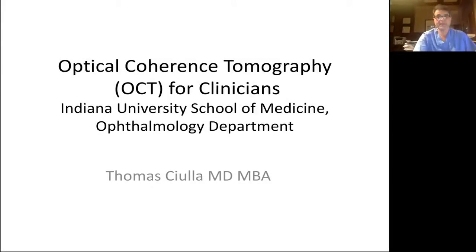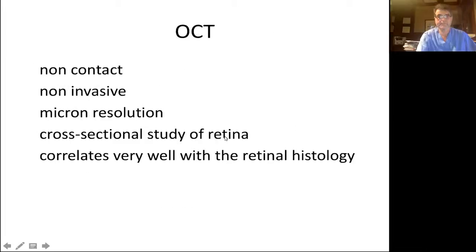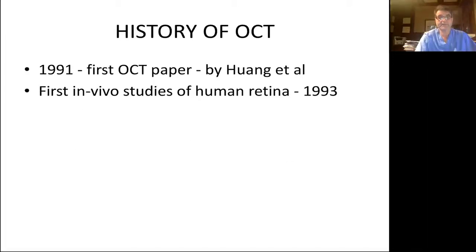And I will be speaking on optical coherence tomography, or OCT, for clinicians. Well, as many of you know, OCT is non-contact and non-invasive. It provides micron resolution of the retina and optic nerve. It provides cross-sectional studies of the retina and correlates very well with retinal histology.